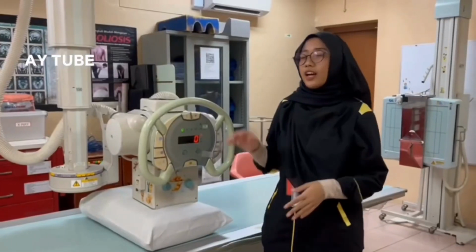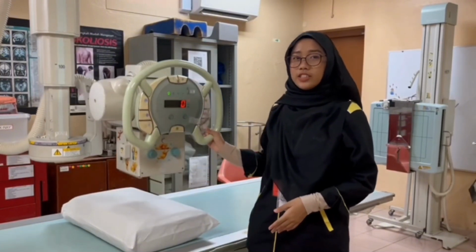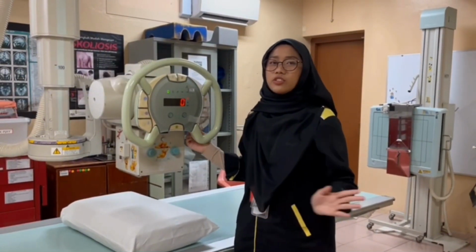introduce you to the key components of X-ray machines and how they work together to create a radiograph like this or like this. Okay, so first, this is the X-ray tube, which is the heart of X-ray machines and it's also the source of X-ray. So how does that happen?